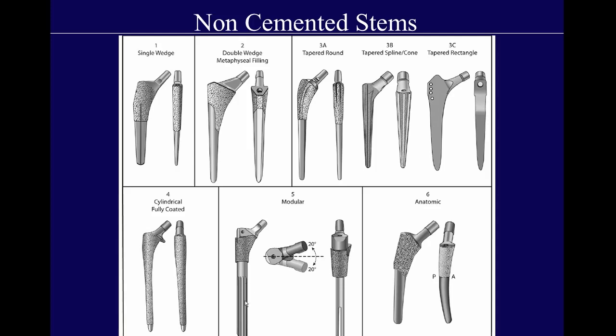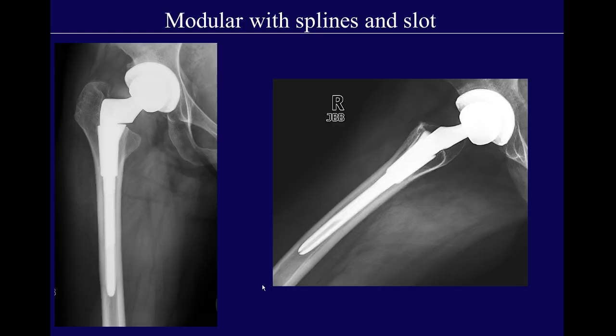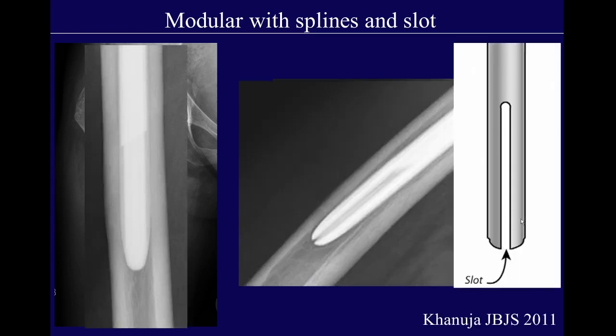In this modular design, you can see the splines, flutes, and the slot. On an EOS image from one of my cases, you can appreciate the splines and flutes very nicely on this modular femoral stem, which allows the surgeon to create different femoral versions. In a different patient, you can appreciate both the splines and flutes as well as the slot — sometimes called a clothespin design. The whole idea is simply to decrease the stiffness of the stem and thereby decrease the possibility of thigh pain.